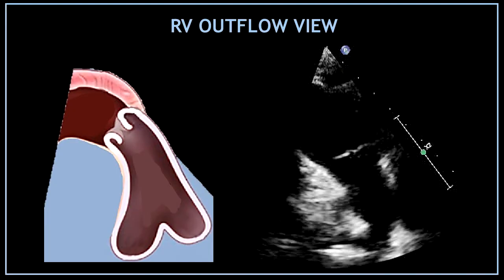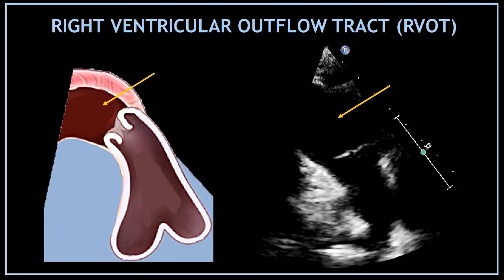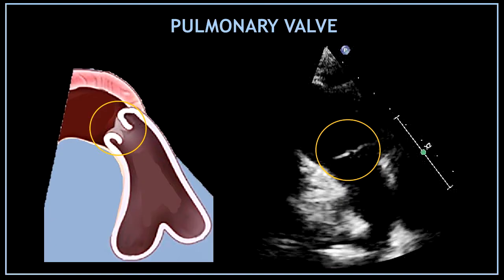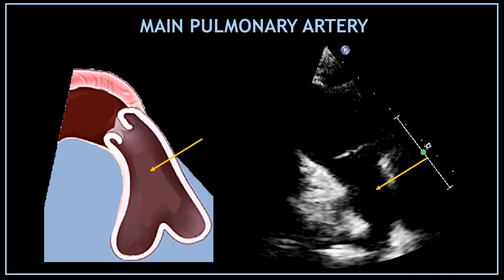Now let's continue with the right ventricular outflow view. I'm going to show you one by one all the structures visualized here. First, at the top of the screen and before the valve we have the right ventricular outflow tract. Now we can find the pulmonary valve just after the right ventricular outflow tract. Under the pulmonary valve we have the main pulmonary artery.